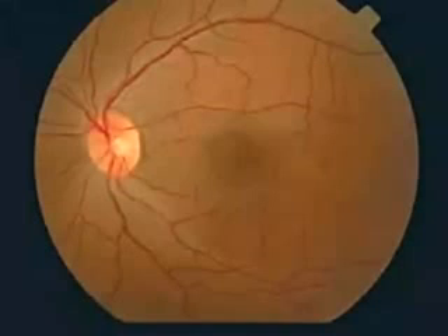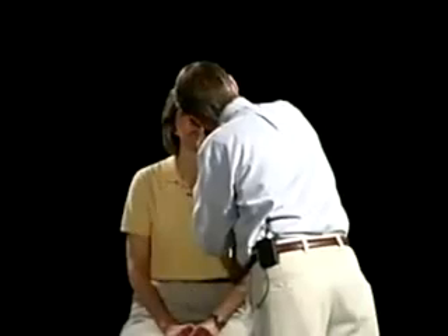I'm going to move to the left side. I want you again to look a little bit out to the right and look right there. Keep watching there even though I get in your way. And again going through and looking at the same structures. Very good.